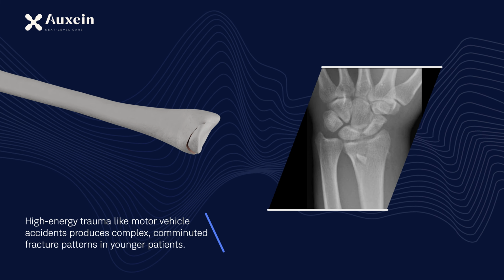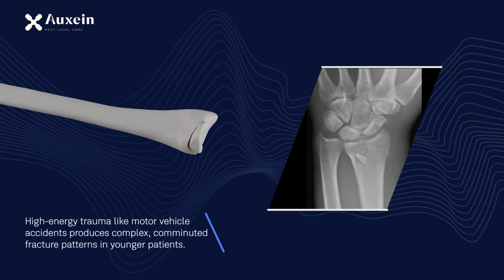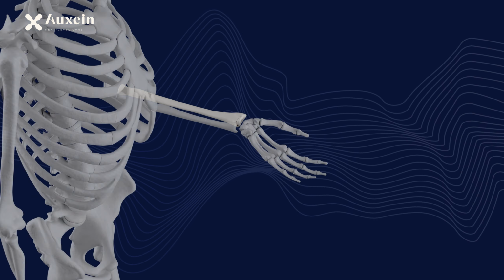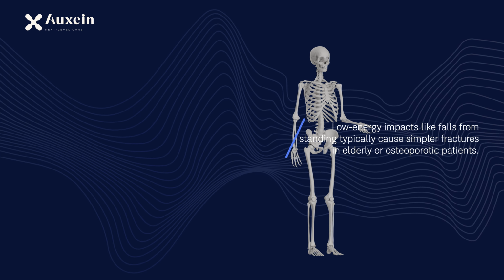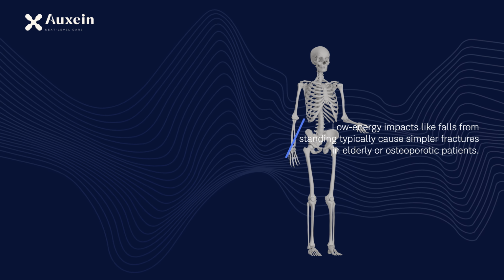High-energy trauma like motor vehicle accidents produces complex, comminuted fracture patterns in younger patients. Low-energy impacts like falls from standing typically cause simpler fractures in elderly or osteoporotic patients.